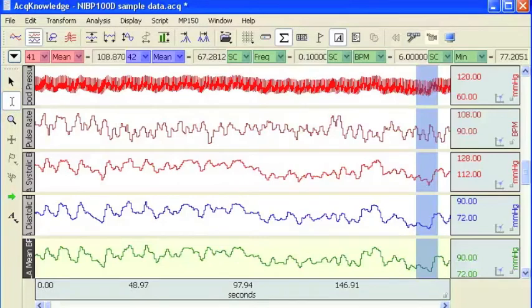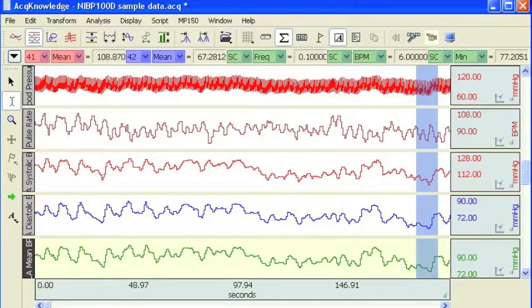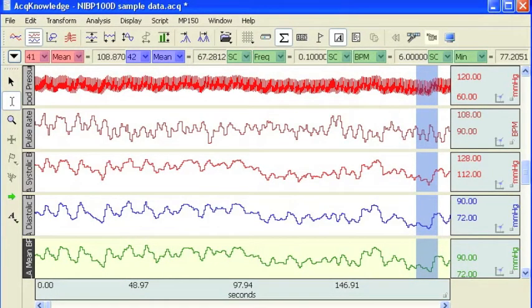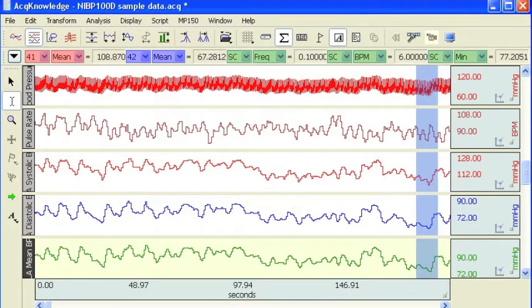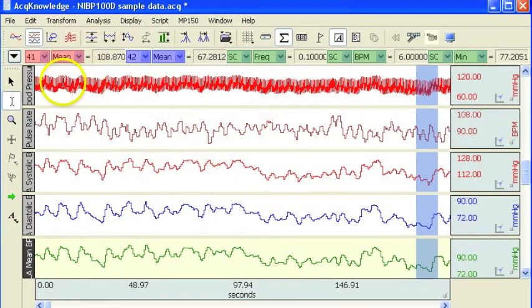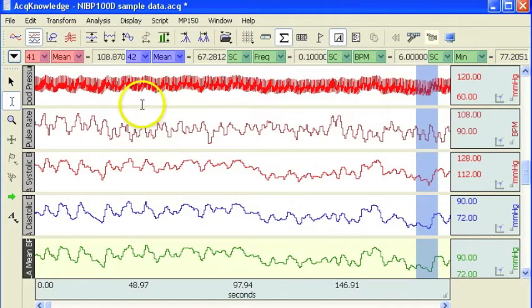The following screencast will demonstrate how to use the AcqKnowledge Epoch analysis routine. The Epoch analysis routine is a very quick way to extract a series of measurements from a data file. It is particularly useful when you have got many channels of data and you want to take several different measurements.